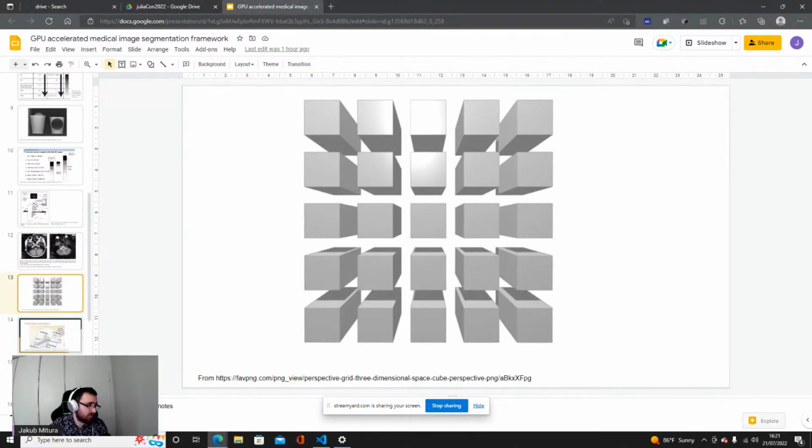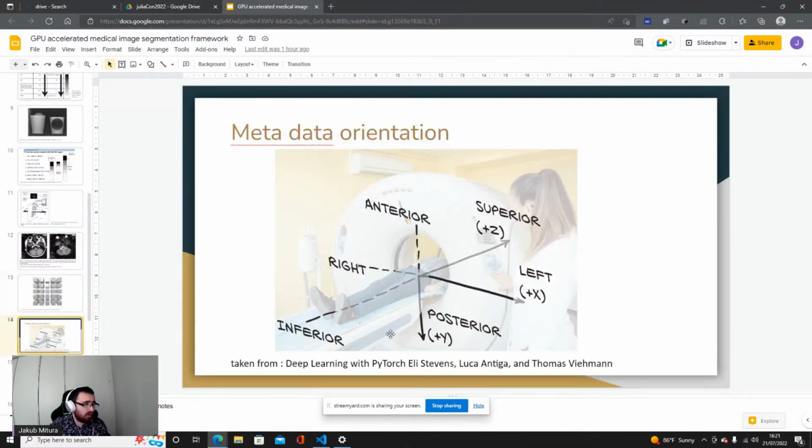What I mean by physical space is that when the patient is lying, we have right, left, superior, inferior, anterior, posterior, and it's important which is which. So in which direction the patient is lying, and where do we start counting, for example, millimeters from the foot, from the head, or from somewhere else.